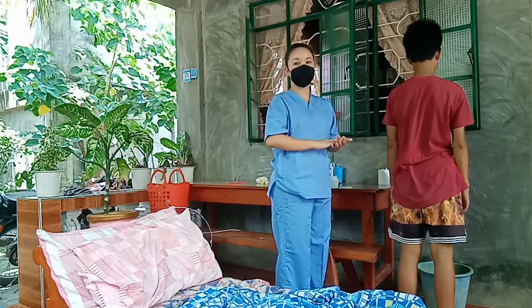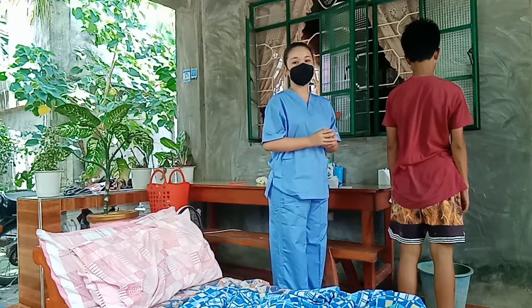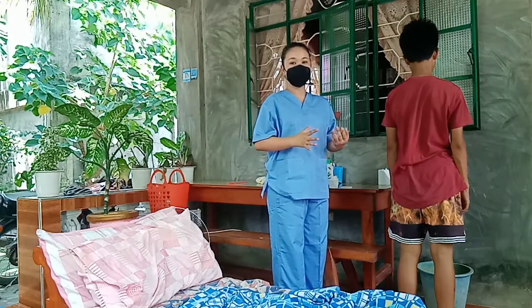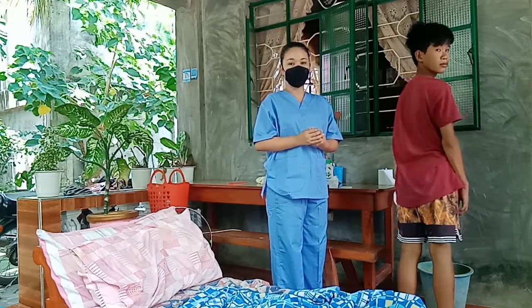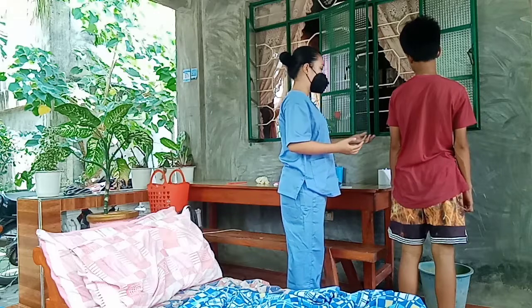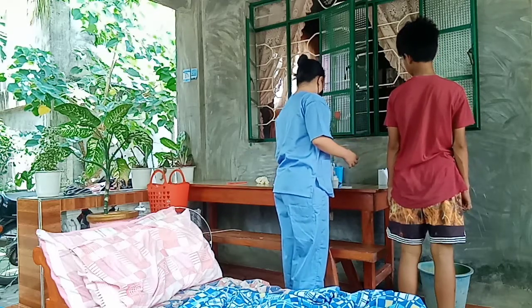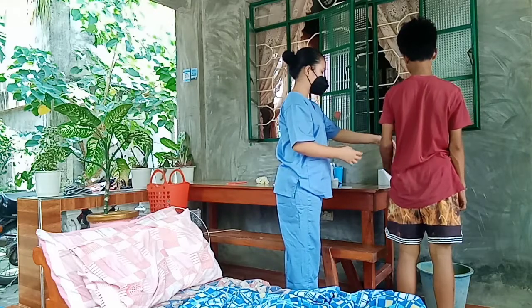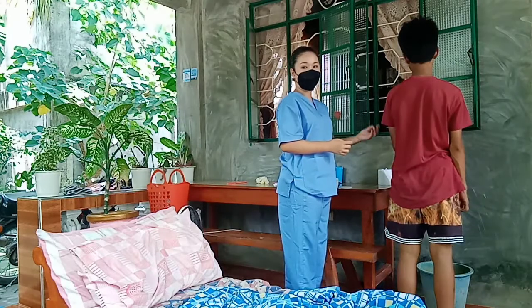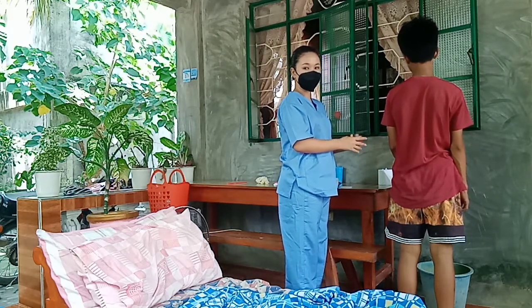So, instruct the patient to hold penis with one hand, then clean the meatus properly and have patient retract foreskin if necessary. Then return foreskin when done. So, sir, hold your penis with one hand. Then next is clean your meatus. Then retract your foreskin if necessary to clean it.